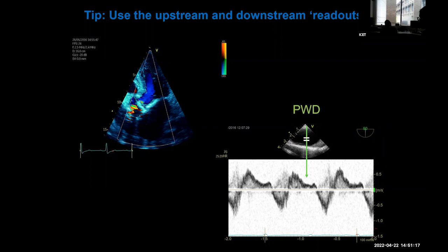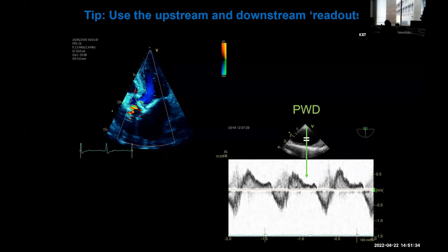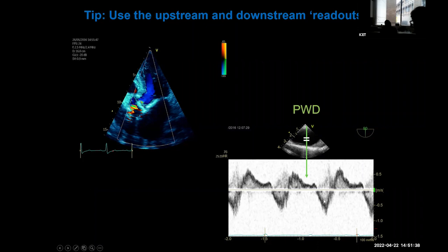When measuring from the suprasternal view, place the pulse wave sample distal to the left subclavian to avoid false positive flow reversal. The abdominal aorta is more sensitive and specific. If you get holodiastolic flow reversal in the descending aorta, that is even better evidence than the suprasternal view.